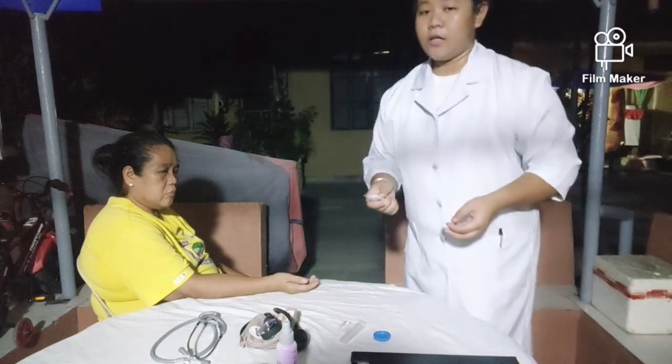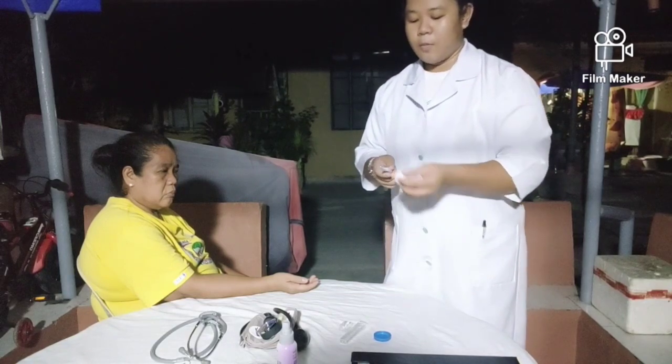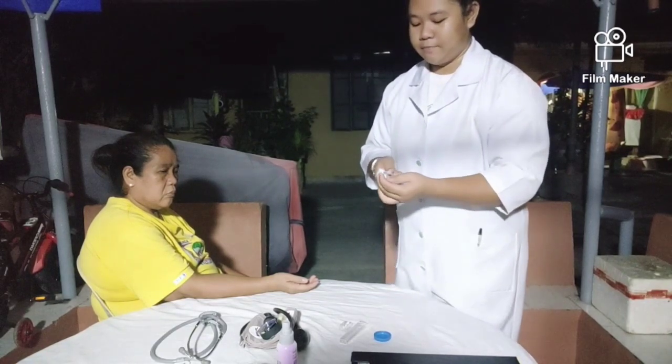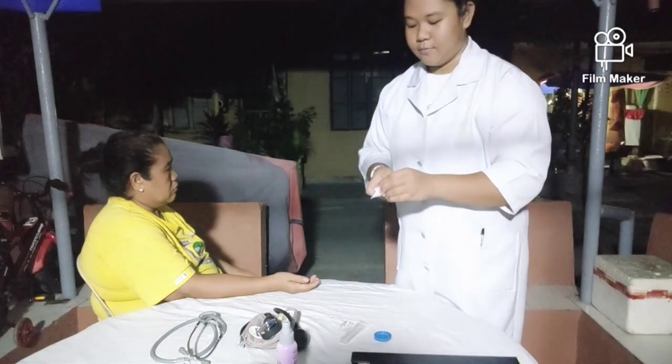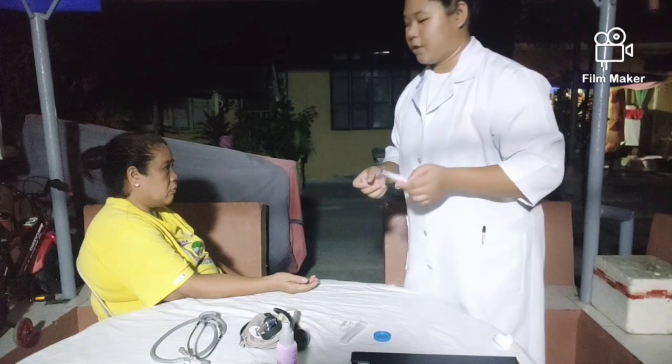Before we take the temperature of the patient, let's clean the thermometer first from the tip to the body. Then, discard the cotton ball. After that, let's find the appropriate site for taking the temperature of the patient.